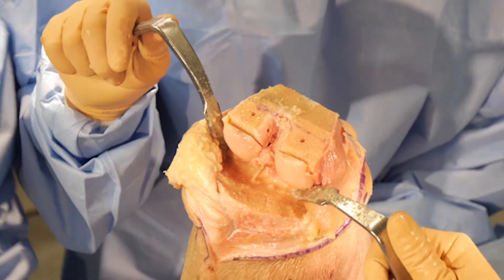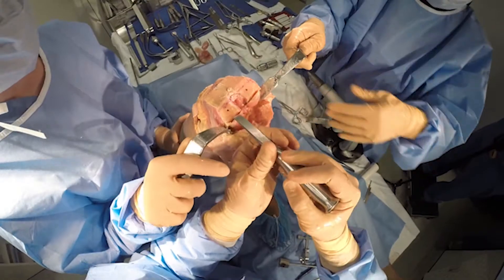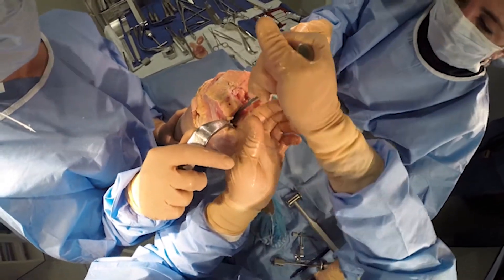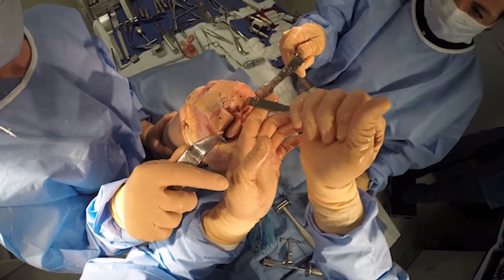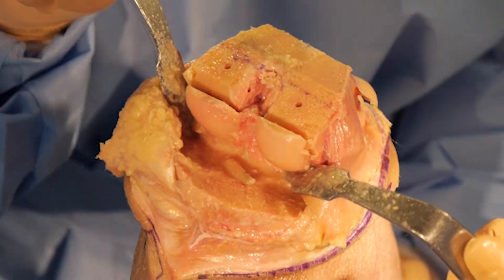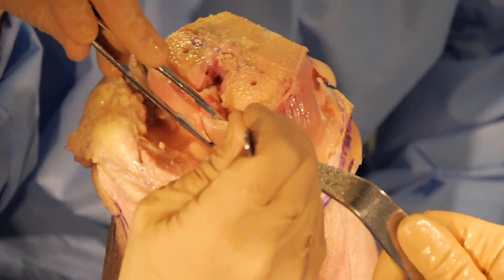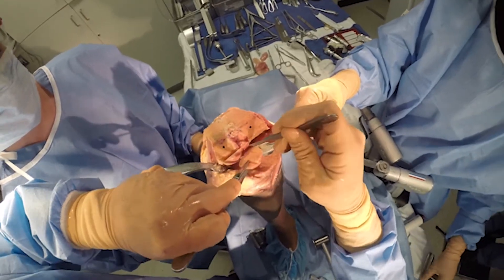I've completed all my cuts on the femur. I can use the slap hammer to remove the cutting guide. At this point you're ready to remove your posterior osteophytes as well as your meniscus. Using the curved osteotome will help you remove your posterior femoral condyle cuts. Then with a knife or a bovie — most of the time a bovie given the nerves and arteries in the back of the knee — we remove this tissue. Today we'll remove it with a knife.